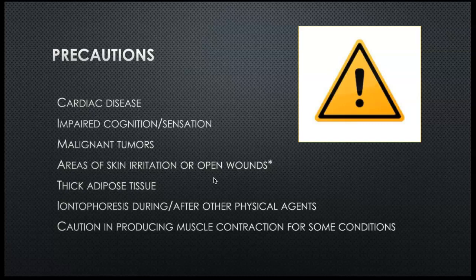You don't put it on areas of skin irritation or open wounds. That is, of course, unless you're treating a wound with the e-stim. But again, you wouldn't do Russian stimulation. You wouldn't put the electrodes over the incision if they just had knee surgery or something like that. Be careful about thick adipose tissue. If somebody has a lot of adipose tissue, remember that's more impedance. So the e-stim might not work the way you want it to in that area. So you've got to consider that.